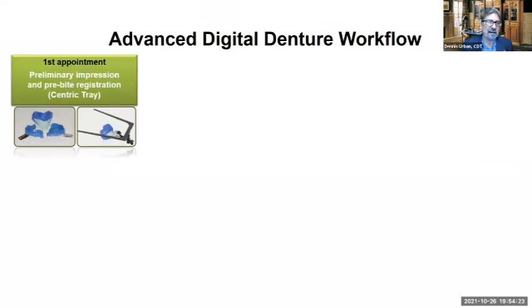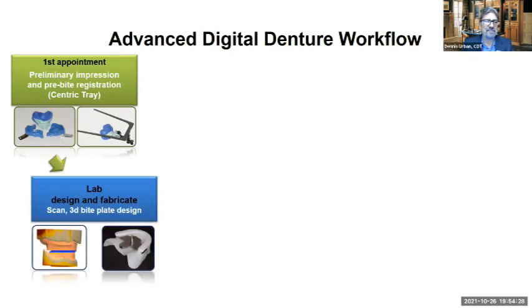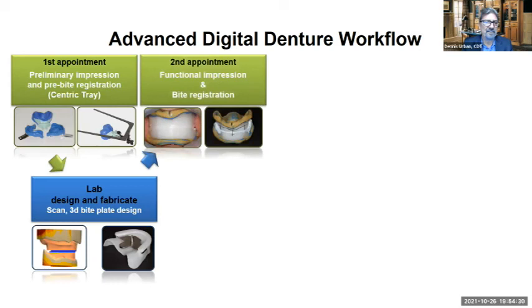You're using a centric tray material with another tool that you can utilize. It's almost like a Facebow transfer. And instead of giving you a bite registration, we print out something called a bite plate, and you can take a Gothic arch tracing record, and that's a little more in detail. And with that information that we have on the UTS CAD, which you see on the upper picture here, it's almost like a Facebow, only you're taking a pre-bite registration and a centric tray.